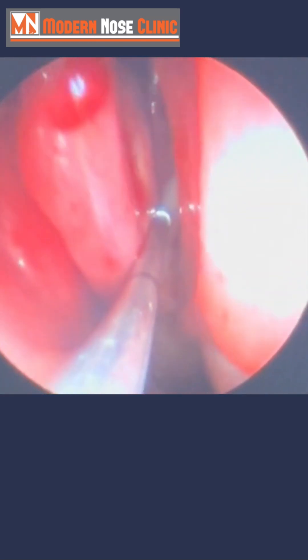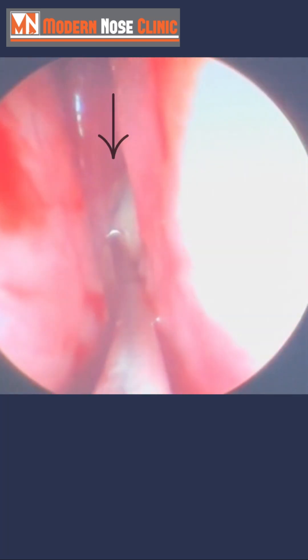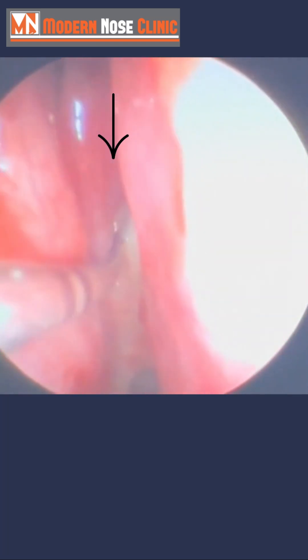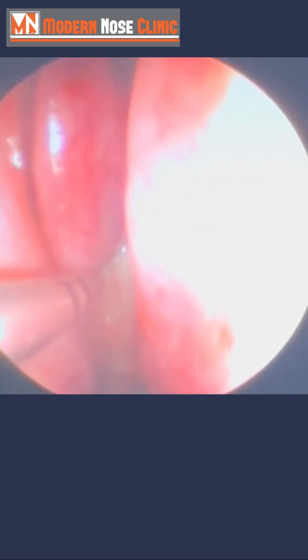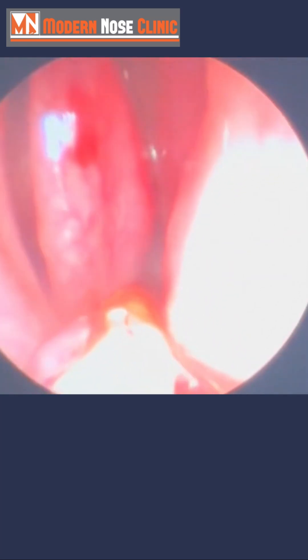Coming on this side, the middle turbinate. Back here, you can see the infection spilling down right there. We just need to find out where the opening is. You can't see any opening, I can't see any opening — but that's going to all change here.